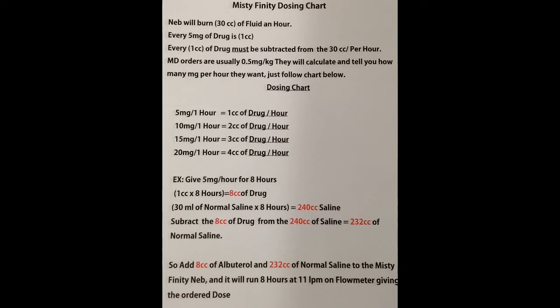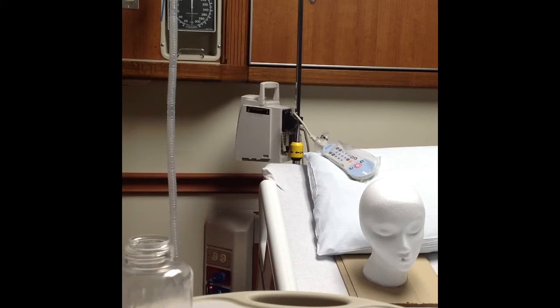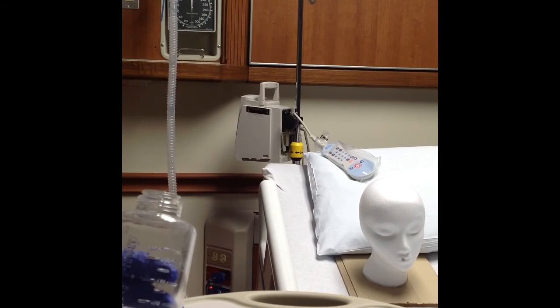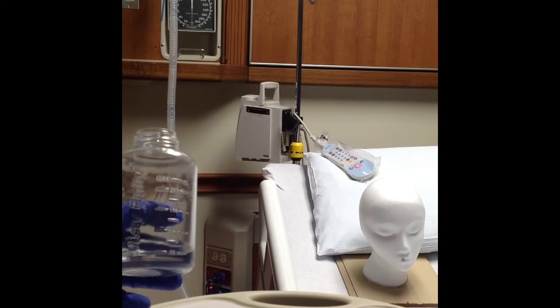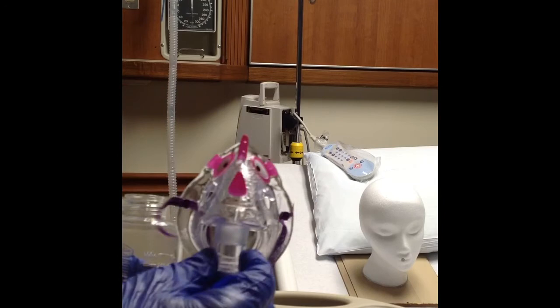Now I'm going to demonstrate how to set the patient up on this continuous neb. The Mistyfinity comes packed with a large bore tubing, the canister for the drug and the saline, and it also comes with this large mask that's kind of similar to our adult mask. I like to use that one.